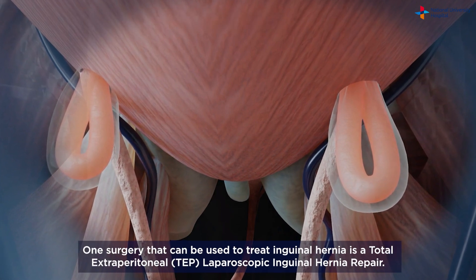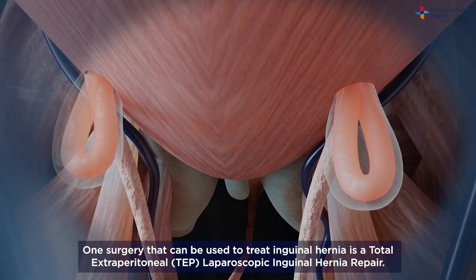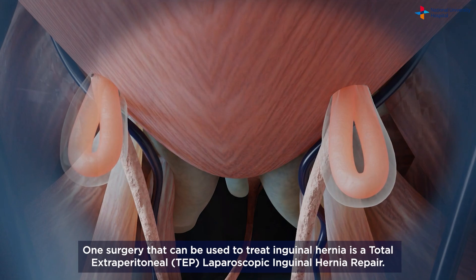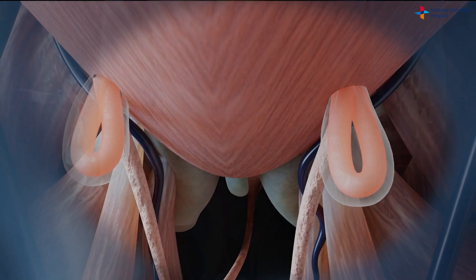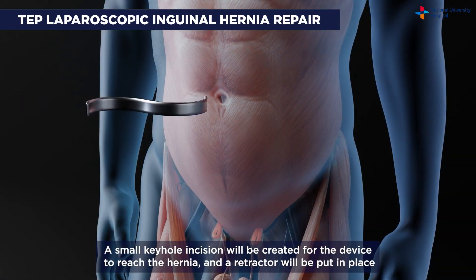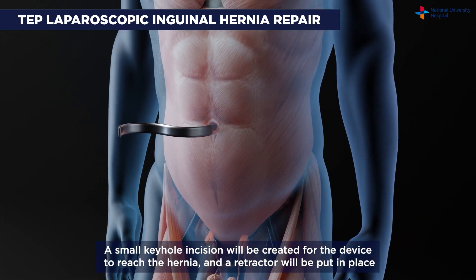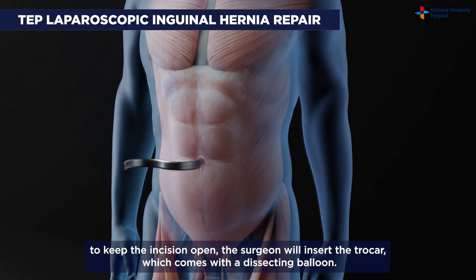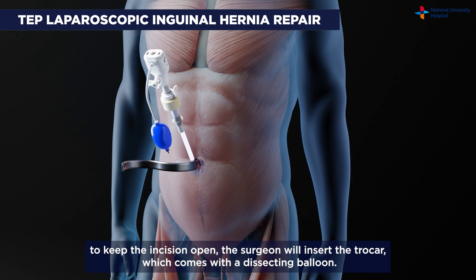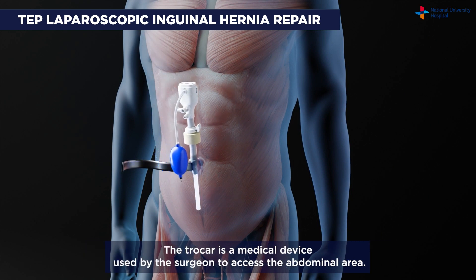One surgery that can be used to treat inguinal hernia is a total extraperitoneal laparoscopic inguinal hernia repair. A small keyhole incision will be created for the device to reach the hernia, and the retractor will be put in place to keep the incision open. The surgeon will insert the trocar, which comes with a dissecting balloon.